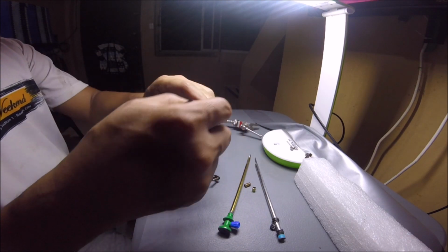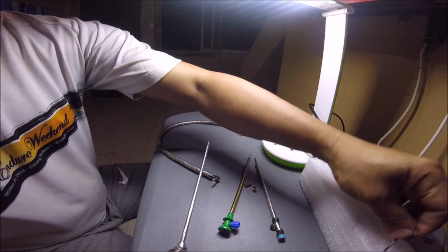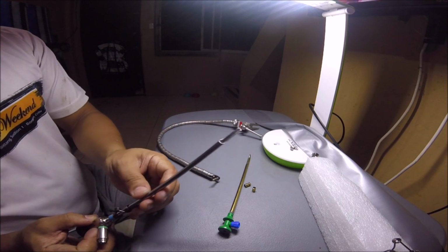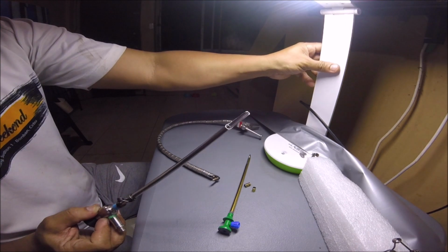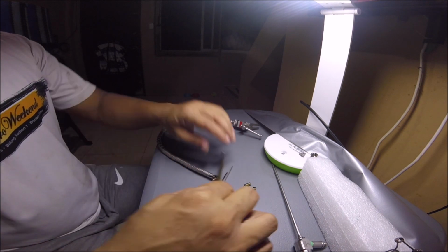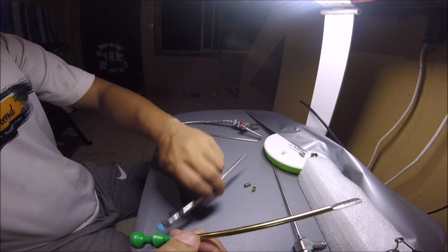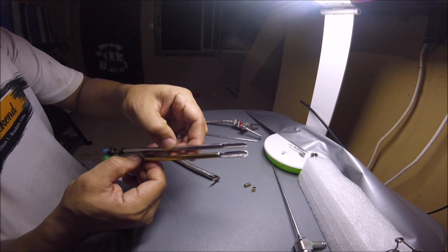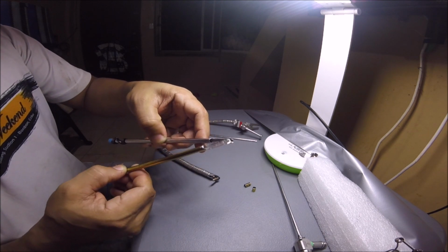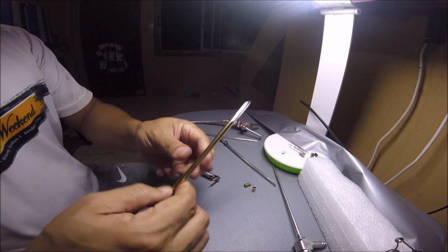Right? So the Layla can hold on to this. Okay, but what if I wanted to use the tubing? Well, of course I can use the old tube. So the tip of the scope is over there. But I revised the tip of the scope into this. I made it wider, as you can see, so that it can retract more soft tissue. I was having trouble with this in certain instances where there was a lot of soft tissue. So by widening it, it can retract more soft tissue. And I shortened the barrel.